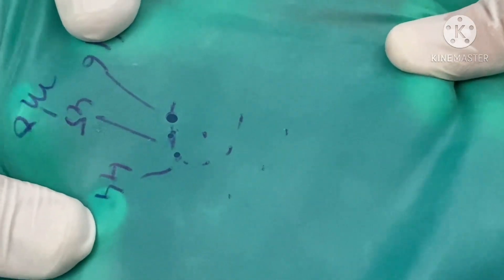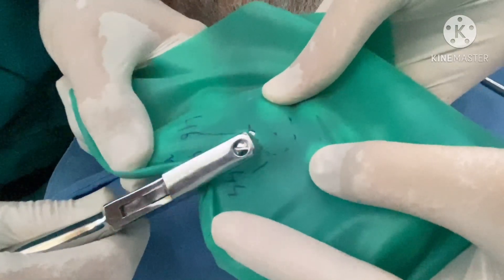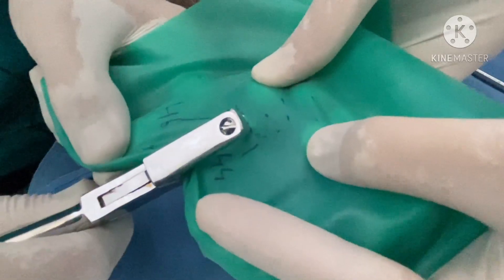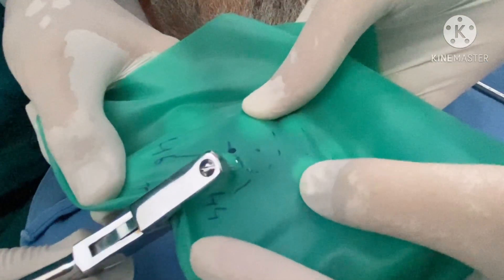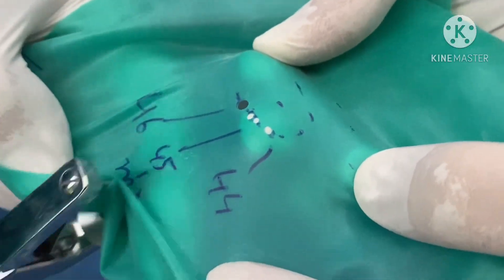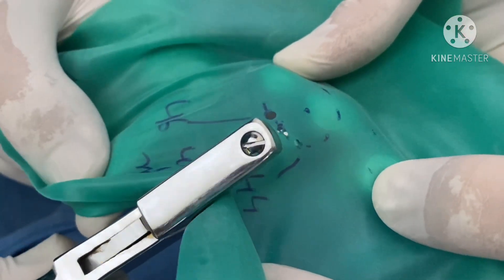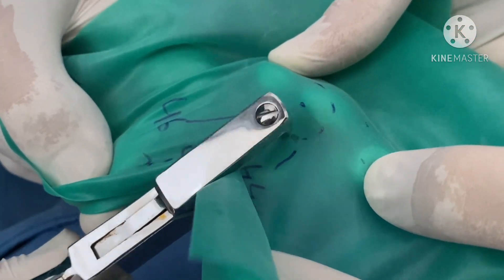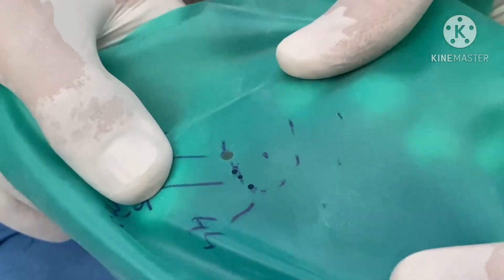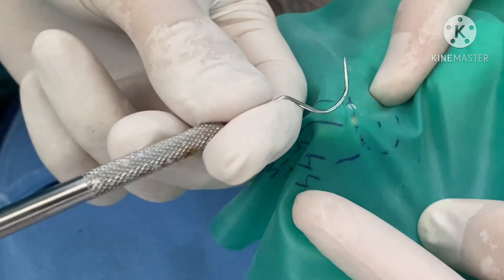Now see the three holes. For the MO cavity, what we do is make additional small holes touching the big hole and bring it forward like this. We check whether we have punched correctly — we have not left any tag, and we try to punch that also. If it doesn't get punched, we can hold it and break it with a pair of scissors.